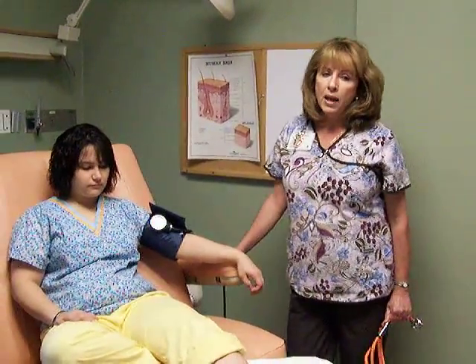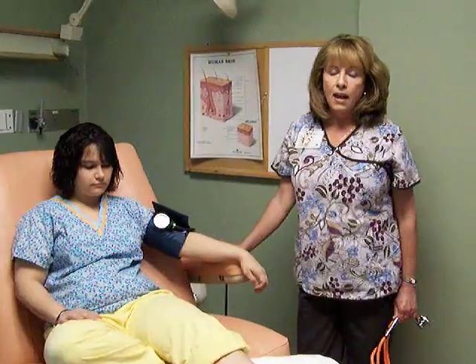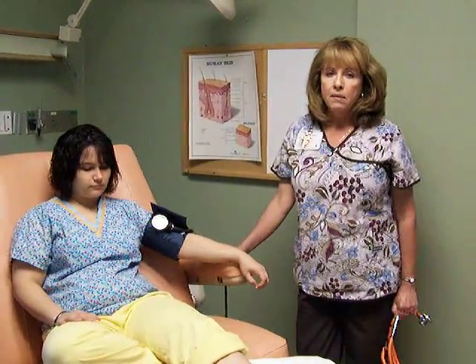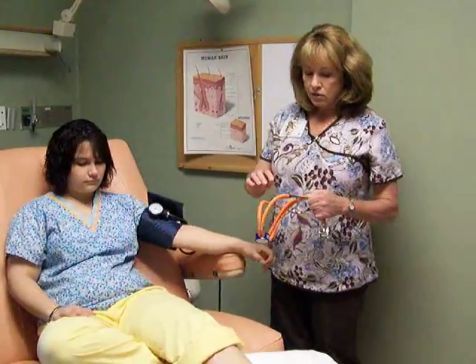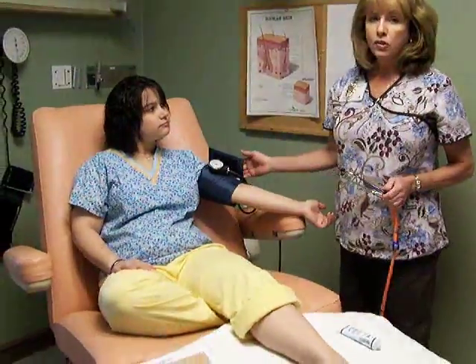Remember that if the patient is a diabetic, an ABI can be falsely high. We'll talk about that after we get the results of this test. First, we're going to put the manual blood pressure cuff on the patient's arm.